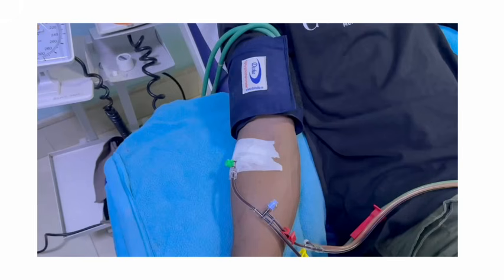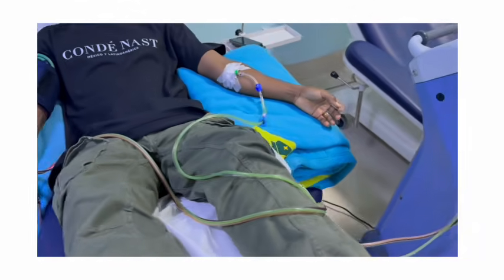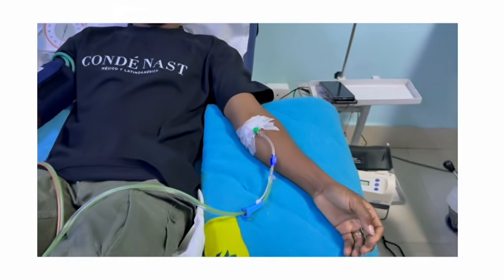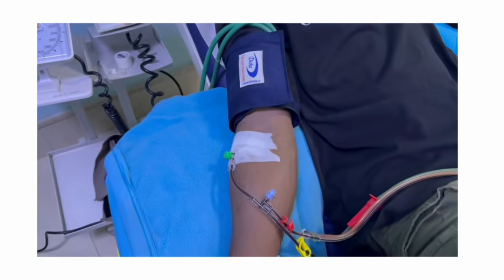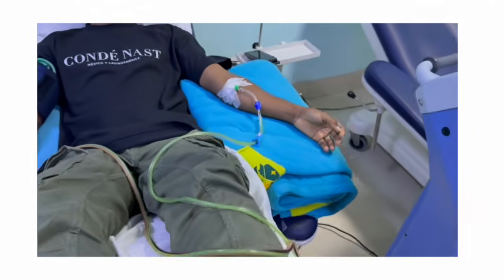So after completing the priming process, both the inlet line, which is red in color, and the return line, which is blue in color, are both connected to the patient through different vascular access. Here, since the donor was having a poor vascular access, we have placed cannula on both the hands to maintain a secured vascular access.